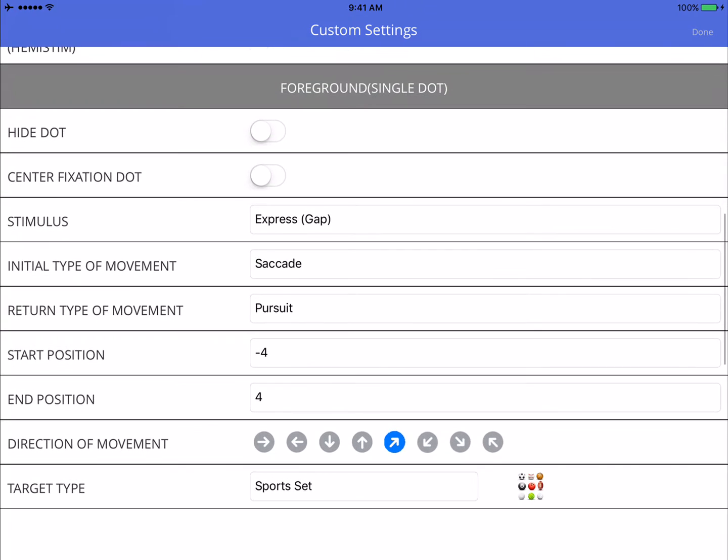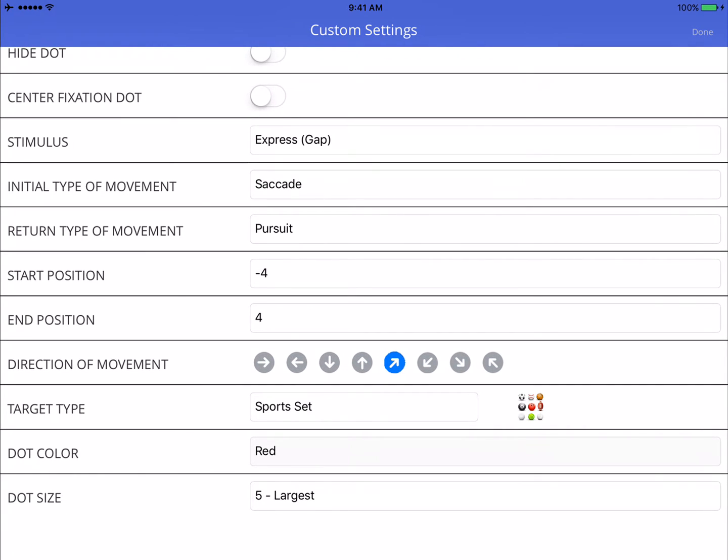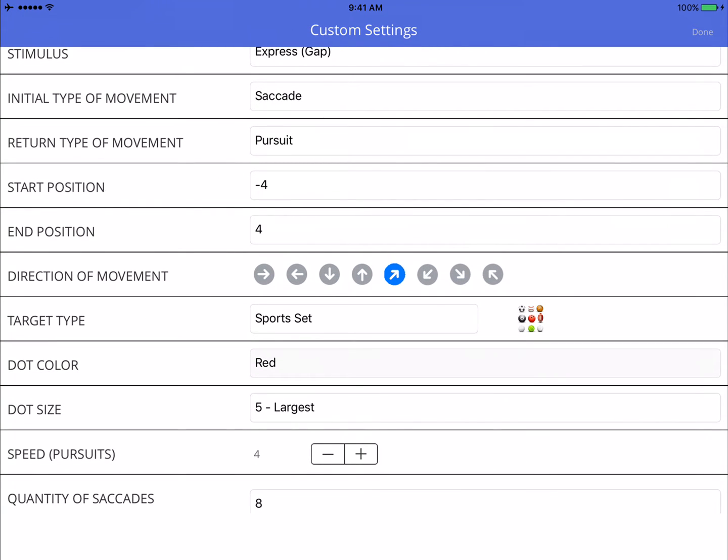Now, in the foreground, I'm going to run a diagonal eye movement strategy. So starting with the bottom left corner, I'm going to have a saccade move up to the right and pursue back down to the left. I chose sports set, so we're going to have sports item as a target just to keep it interesting. And I'm also going to run the same exercise in the opposite direction as well, and we're going to alternate like that.